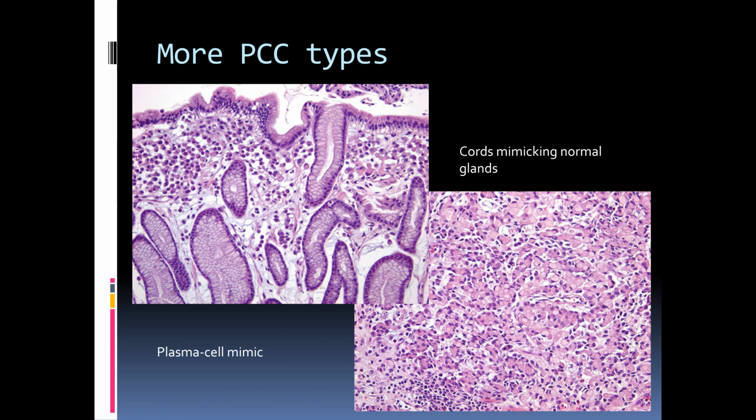And so in a gastric biopsy, patients with dyspepsia or other lesions, you know, just looking and scanning at low power may set you up to miss this. And I think this is one of the reasons why in many practices, the QA function of second review for most gastric biopsies, or certainly for any gastric biopsy in a patient with a history of ulcer disease or anything like that, is highly fruitful.